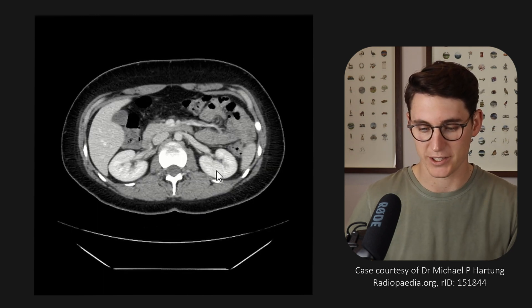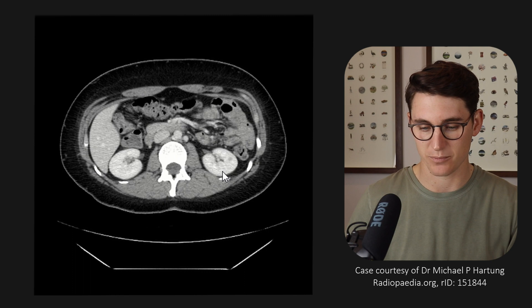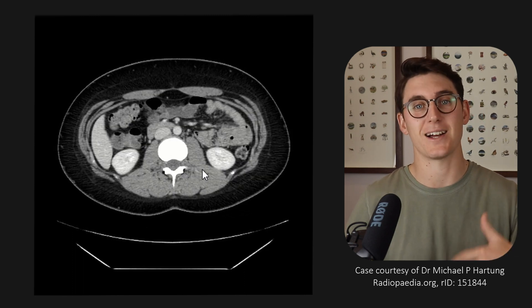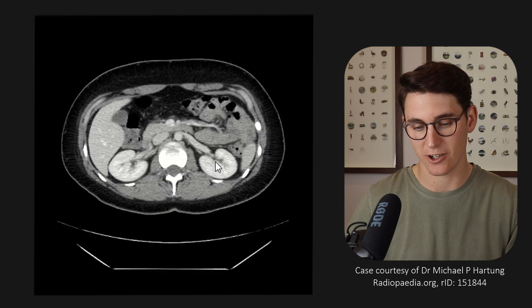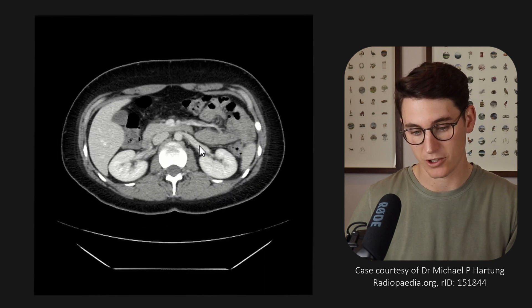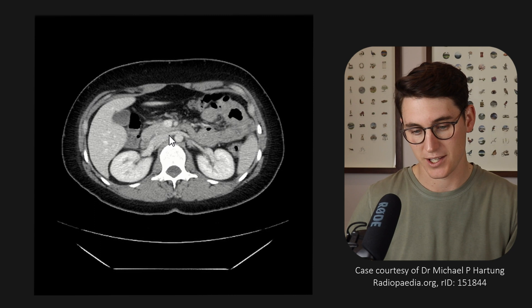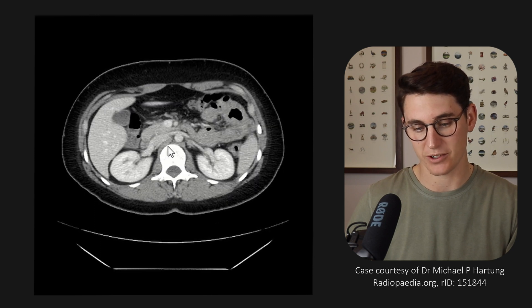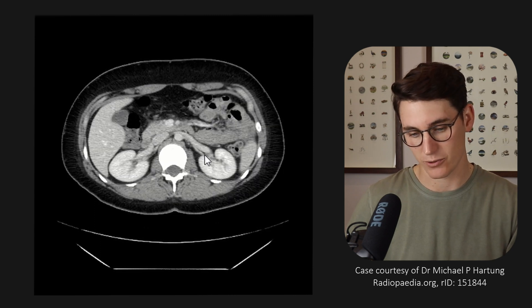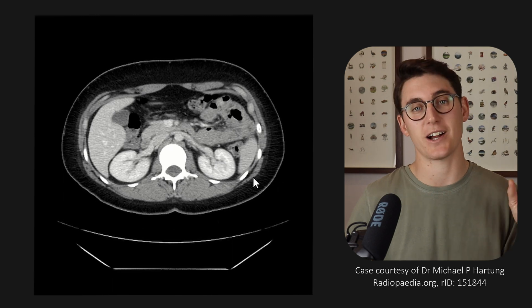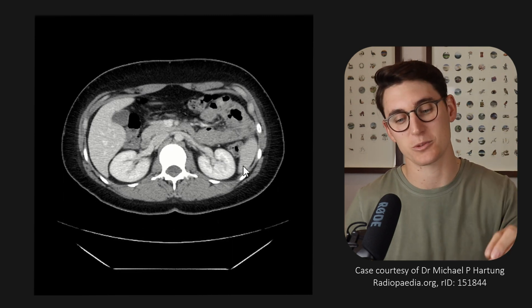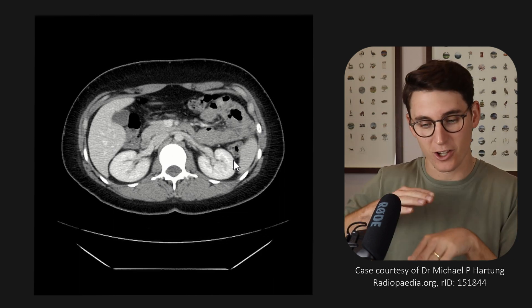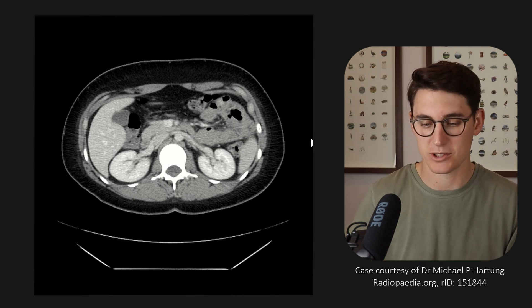Let's follow those kidneys all the way down to the inferior pole. We can scroll back up to the hilum of the kidney where we should see our left renal vein coming across the aorta, as well as our right renal vein heading into the inferior vena cava. We can also see our renal arteries, and this is where our collecting system becomes our proximal ureter that heads down towards the pelvis along the front edge of the psoas muscle.